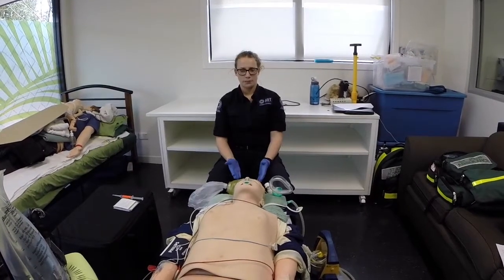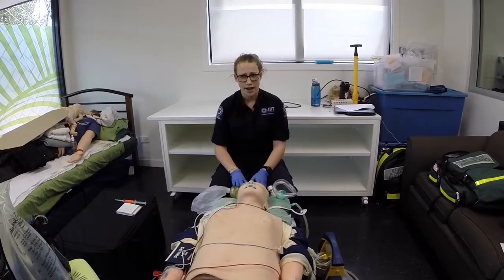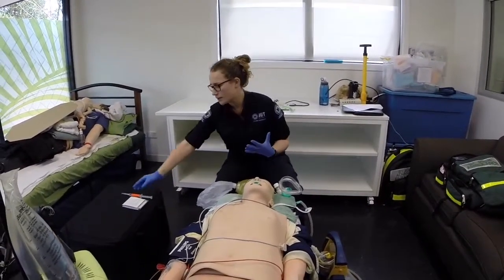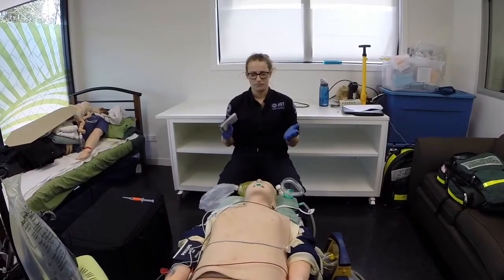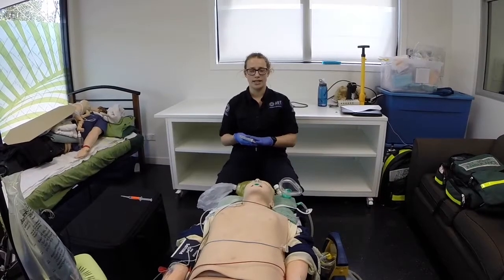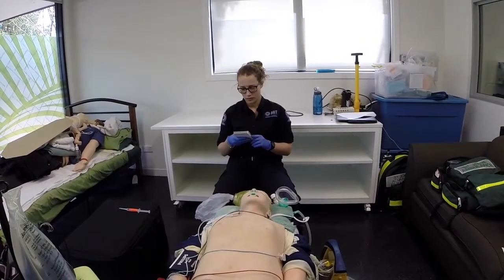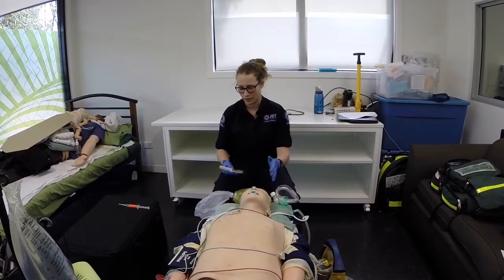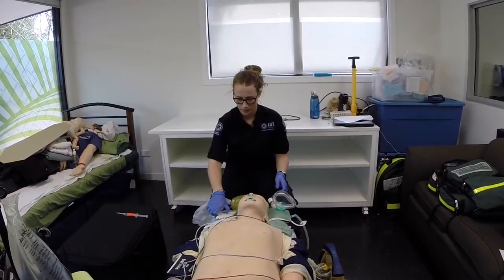Now that we've managed this patient's TBI, we can now prep for RSI. So my offsider and I will verbally check with the checklist for everything we need for RSI. So attached nasal prongs. Yep, so we've attached nasal prongs with supplementary oxygen flowing. Pre-oxygenate using a reservoir mask at 10 litres per minute.